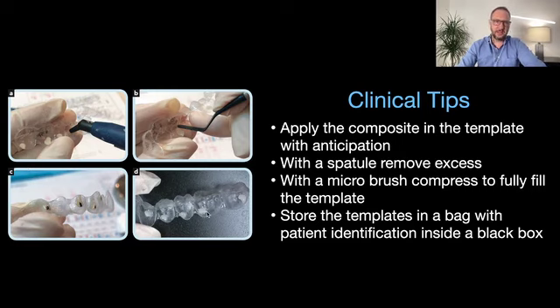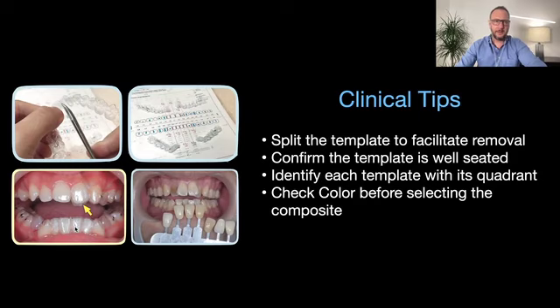They indicate here in the article to paint in black where you have attachments, because this is very transparent, and sometimes we miss one attachment and we bond everyone and then realize, okay, I missed the second molar there. So this way you can remind yourself where you have attachments there, okay?